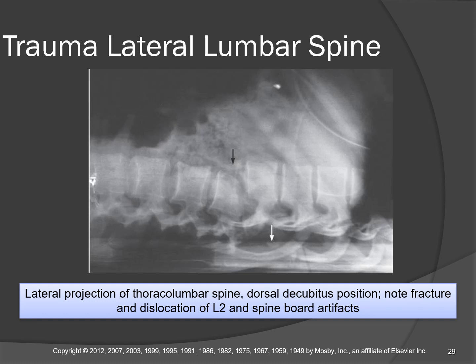Notice the patient's underwire bra artifact. While it's not critical to the lumbar spine, it may affect visualization of the thoracic spine, particularly in the AP view.